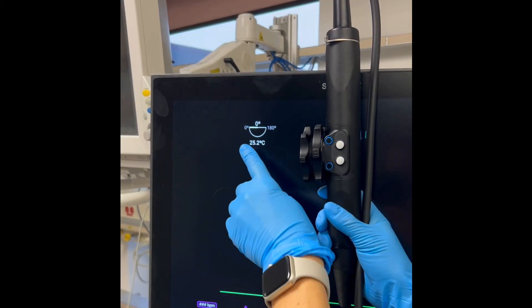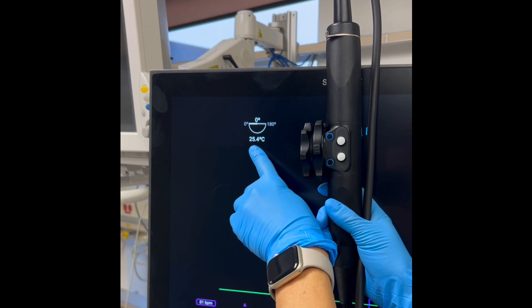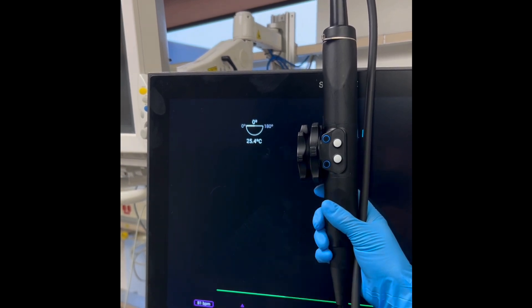The temperature of the probe head is displayed below the crystal angle. Be mindful of this number, as the temperature can increase with prolonged and advanced image collection and can inflict a thermal injury.